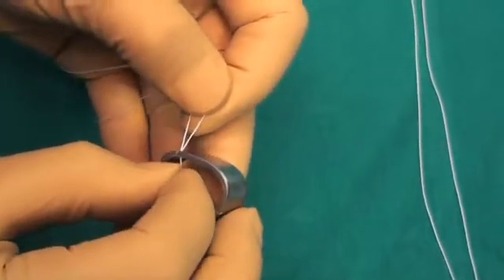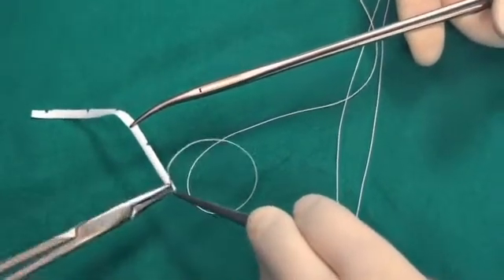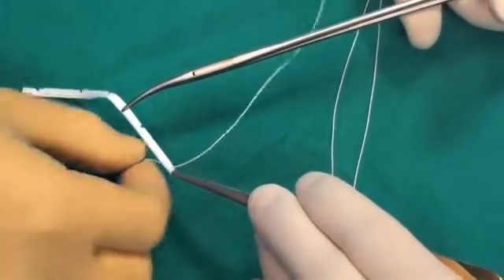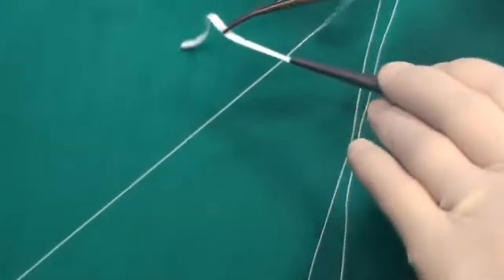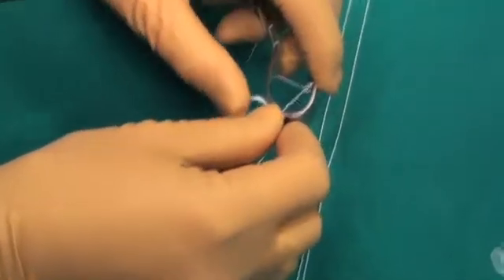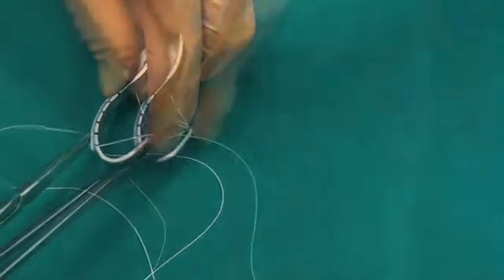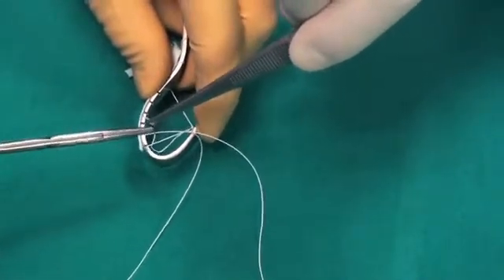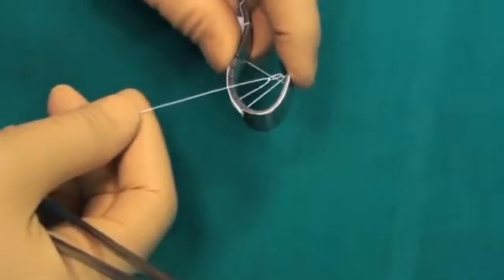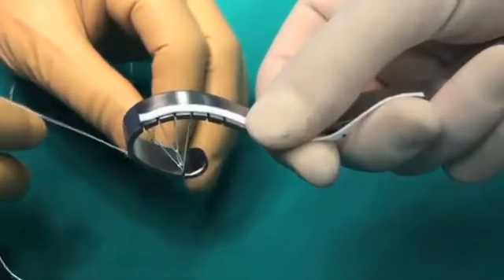The build-up starts with the insertion of the loop. After that, we pass the stitch through the strip and place the strip over the upper portion, over the edge of the Faraboeuf. Then we go up and down between the strip and the loop. Finally, we join both stitches and knot them to form the base of the corda system.